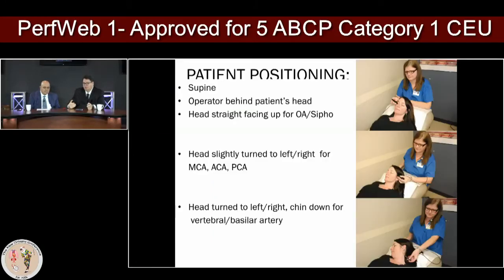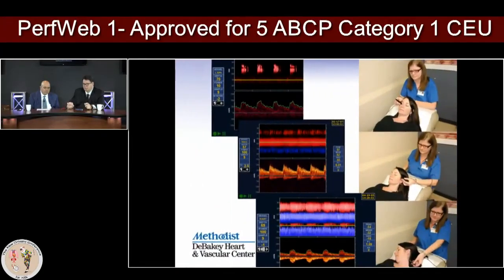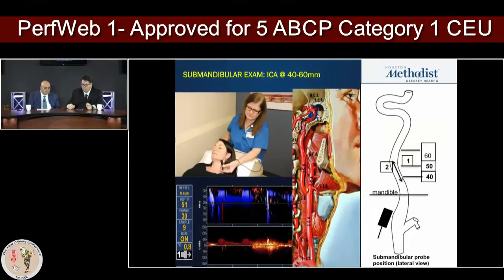And this is how the sonographer is positioned for the diagnostic TCD. We're sitting at the bedside at the patient's head, and we start with the ophthalmic window, then go to the transtemporal window, and finally the transoccipital window. Through these diagnostic tests, these are the different signals we can use for monitoring in the operating room or even in our office. We do utilize a head frame, and later I'm going to show you the head frame.